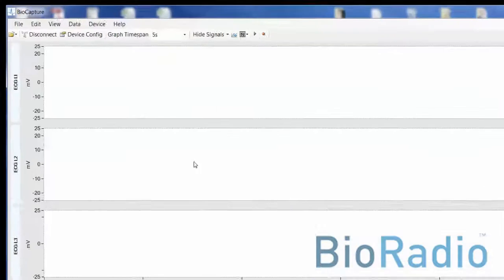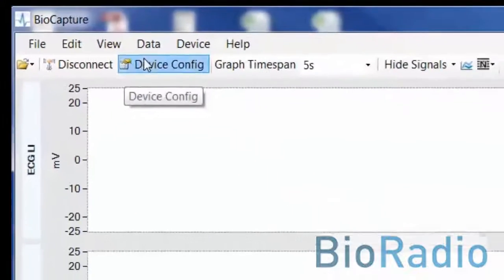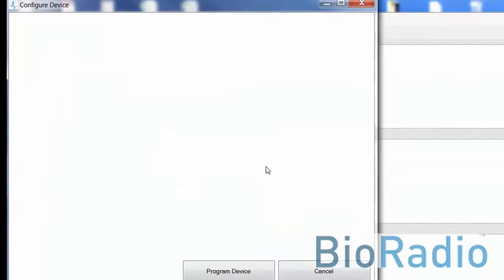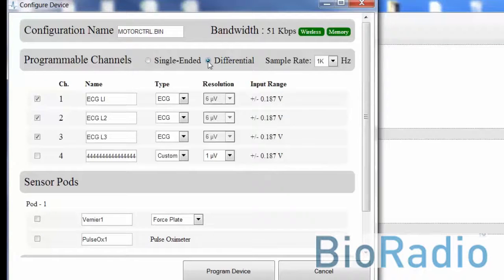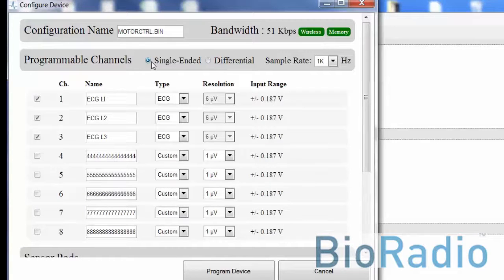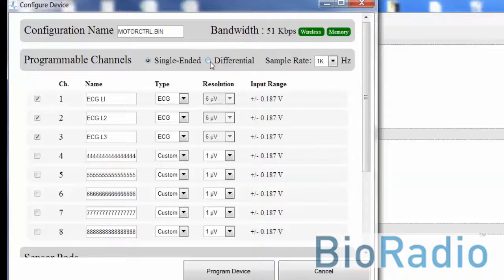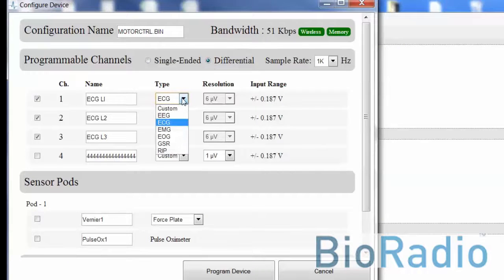After connecting the BioRadio, confirm that the BioRadio is properly programmed by selecting the device configuration. Here is where you can program it for single-ended or differential channels. For this demo, we will be doing a differential channel.